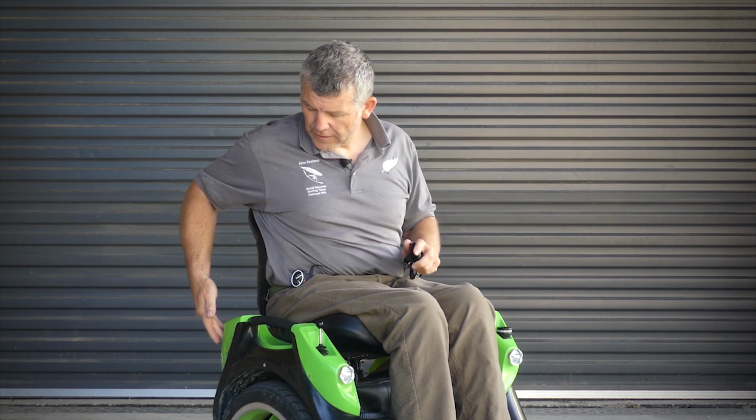Of course, when you're in this situation and you've gone through the emergency shutdown, remember to power up the machine again. If you ended up sitting here and pushing that rear button 3 times to activate the legs would come up, but you would have no power, and then you'd be lying down very quickly.